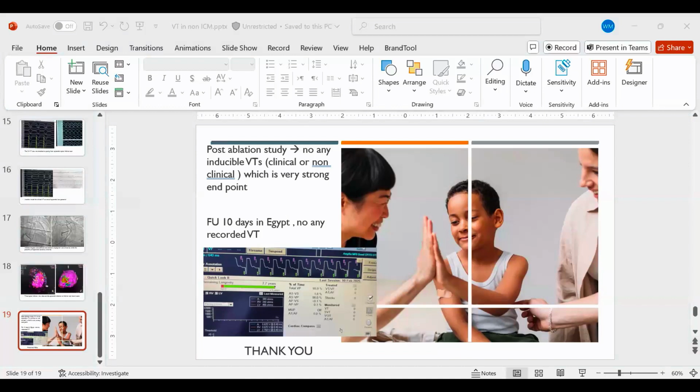Such a nice case. I have a question for you till we get the questions from the floor. What do you do about your anticoagulation when you decide to do an epicardial puncture after you have already done your endocardial mapping and you must have given heparin? Can you elaborate on what you do in particular? Do you reverse? Do you not reverse? Do you feel comfortable doing the puncture after giving heparin?